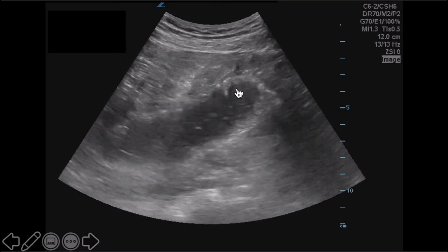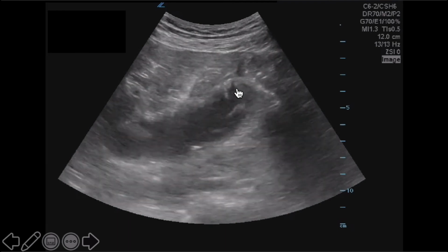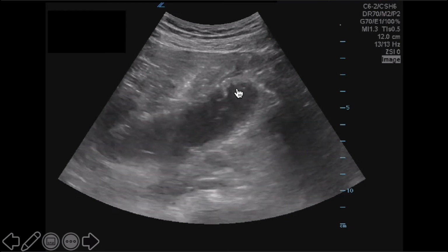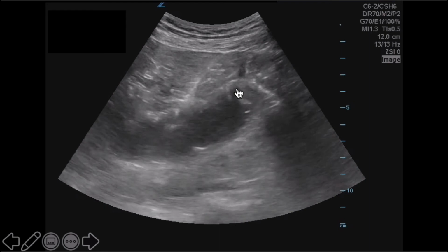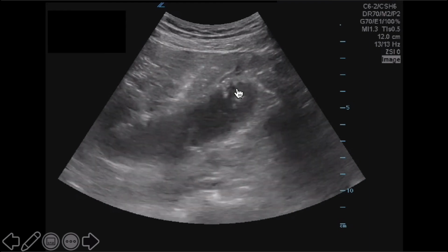Sorry about the little diversion into abdominal aortic aneurysm ultrasound. Based on the patient's ultrasound imaging, it clearly did not see an aneurysmal dilation of the aorta. While the ultrasound was still at bedside, the decision was made to view the area where the patient was most tender, in the area marked with the X. The above clip is what was identified.